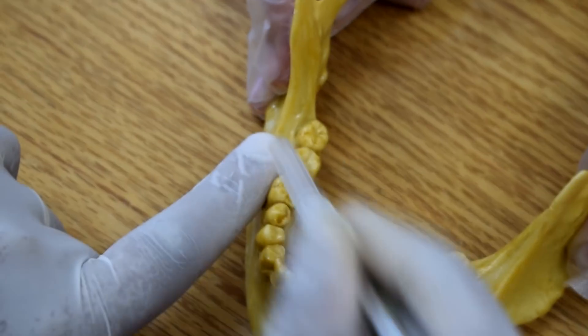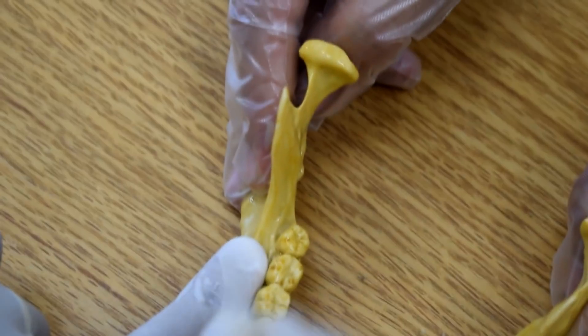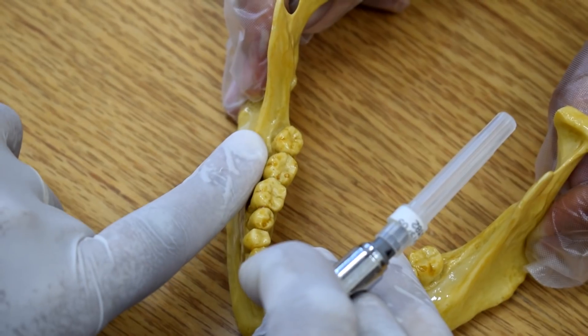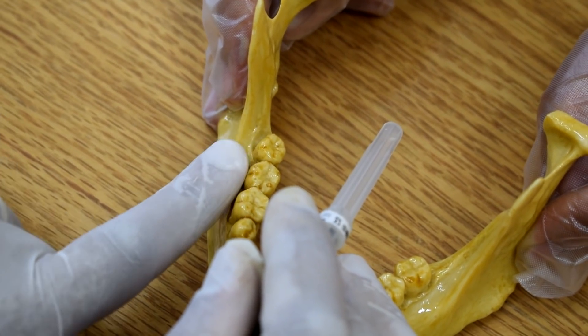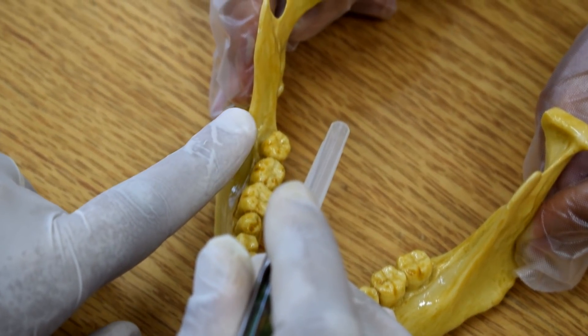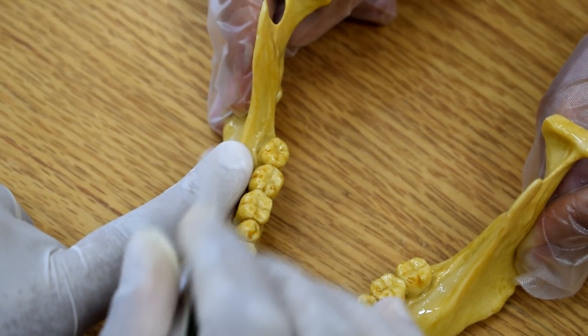Now I'm feeling it by the midpoint — the mid area of the midline of the mid portion of my finger. While I'm going posteriorly, I have to move my finger medially, like this. Don't allow the external oblique ridge to displace you laterally. Do not keep the external oblique ridge under the middle of your finger.